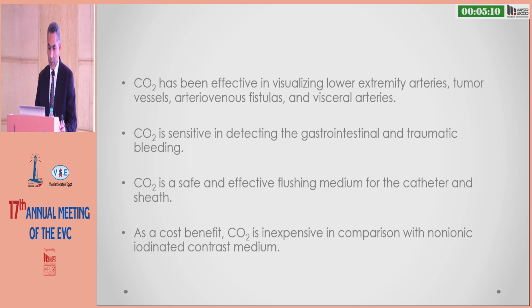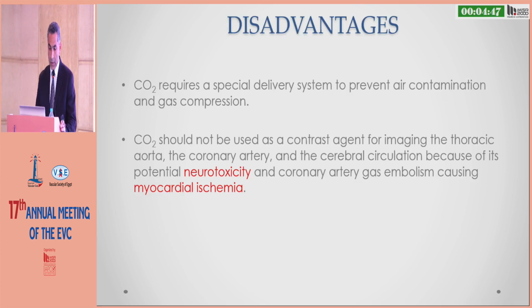CO2 has been effective in visualizing all vascular applications, venous and arterial, and AV malformations. It can be used in the gastrointestinal tract and for traumatic bleeding, and it is safe and effective as a flushing medium for catheters, and it's considered cost effective compared to non-ionic iodinated contrast medium.